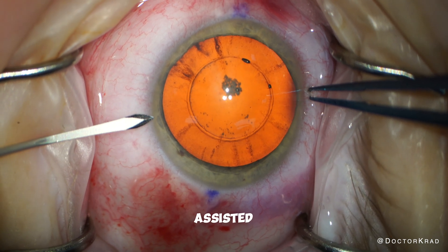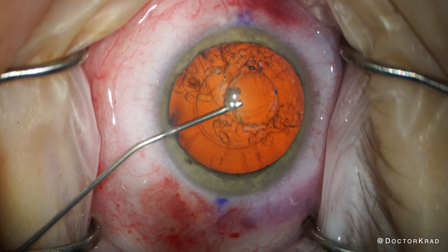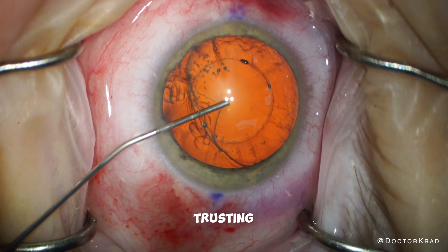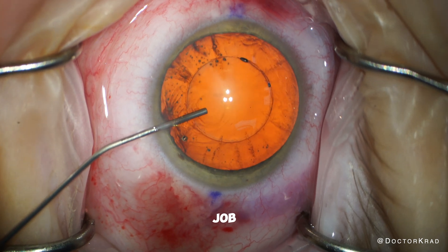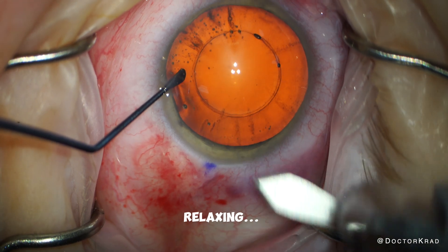With laser assisted cataract surgery, the laser performs certain steps of the procedure for me. I can sit back and relax, trusting the laser to perform its job. Sometimes it feels like I'm being chauffeured around town in a luxury limousine. So relaxing.